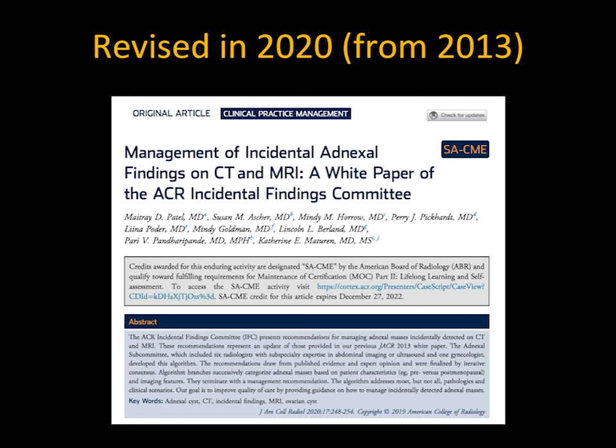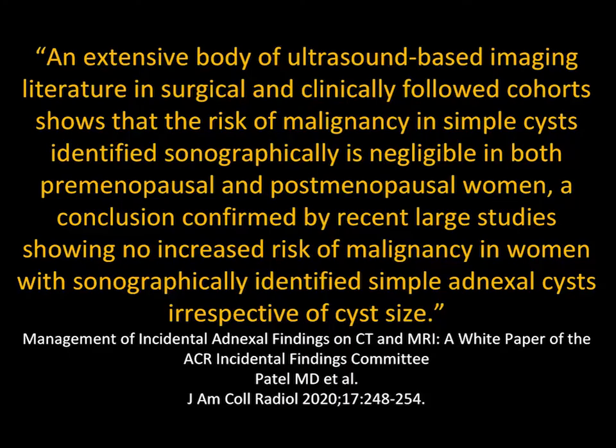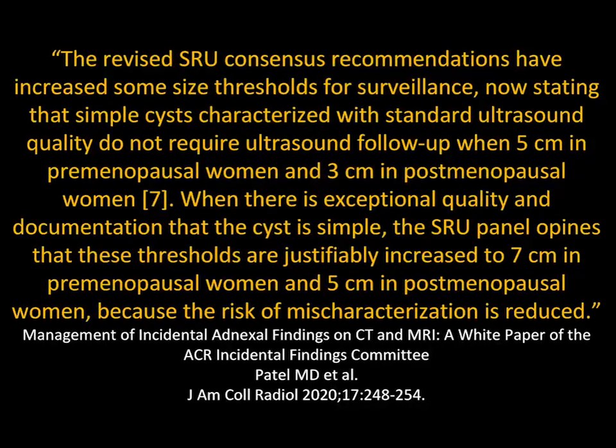Now, the adnexal findings, incidental on CT and MR, was just recently updated, and it made it a little bit simpler. It really looked at whether someone was pre or postmenopausal, but had a much more logical approach where the assumption was most lesions were indeed benign. The new criteria, for example, simple cysts characterized with standard ultrasound quality do not require ultrasound follow-up in 5 cm in premenopausal women and 3 cm in postmenopausal.